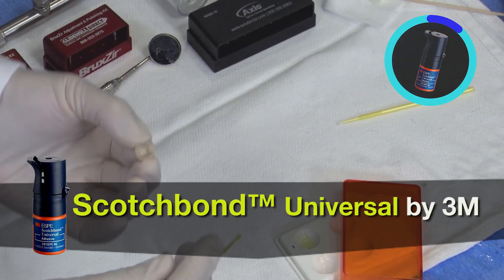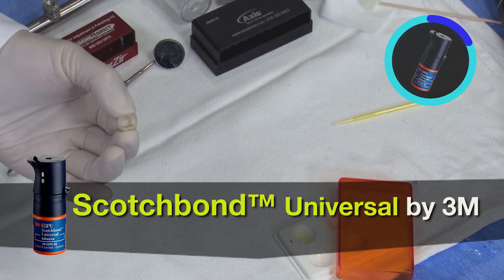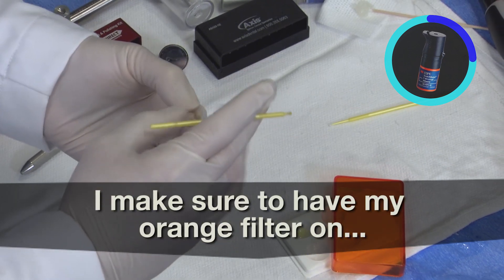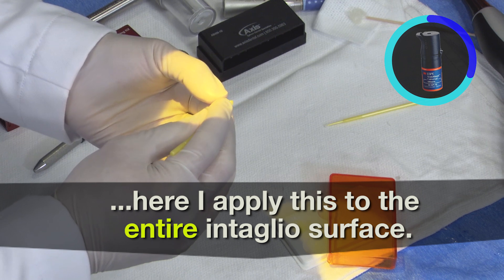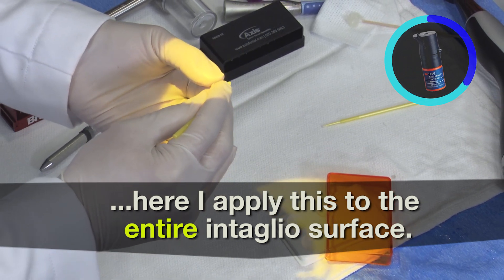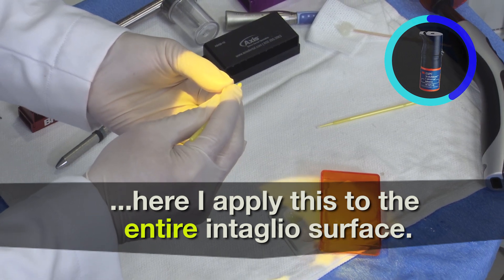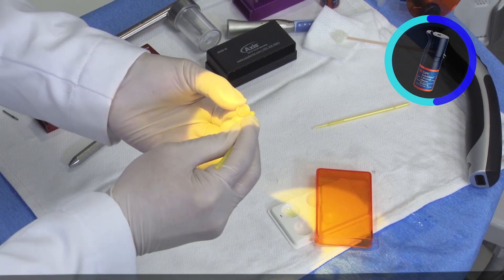In this case, because I'm using a universal bonding agent, the bonding agent also contains some methacrylate and light sensitive monomers within it. So I make sure that I have my orange filter on, and here I apply it to the entire intaglio surface because we certainly want that MDP primer to come into contact with the entire restoration including the margins of the restoration.